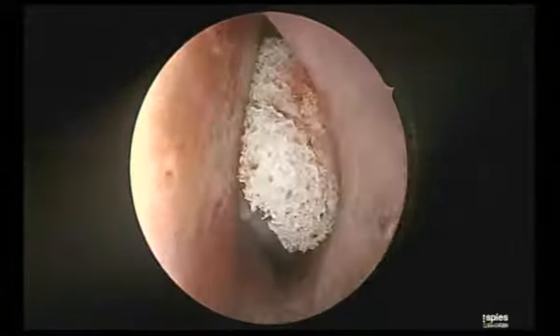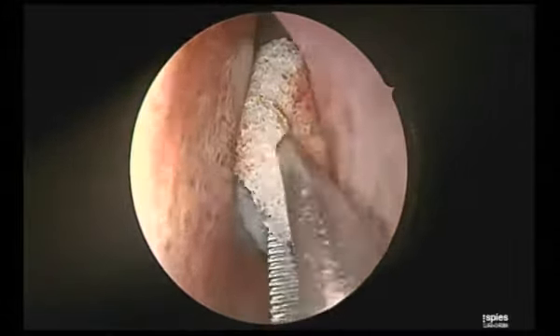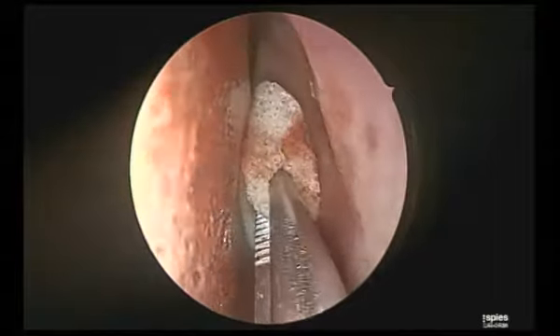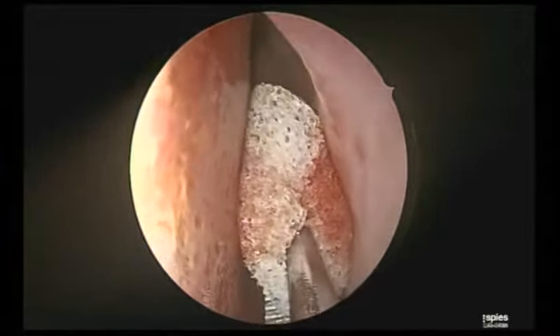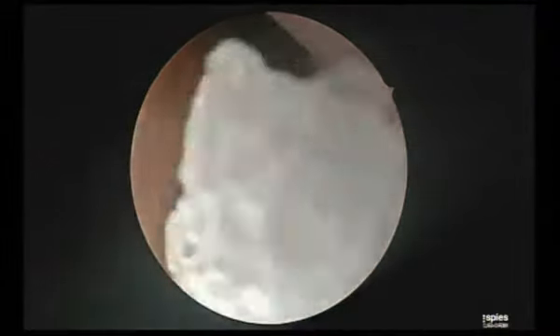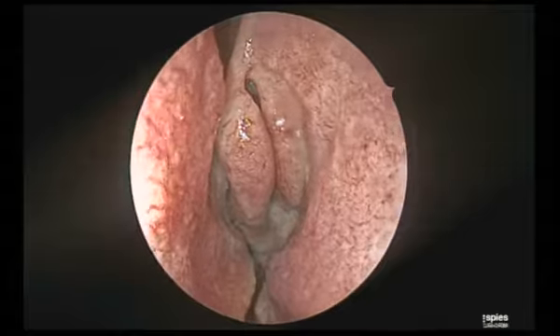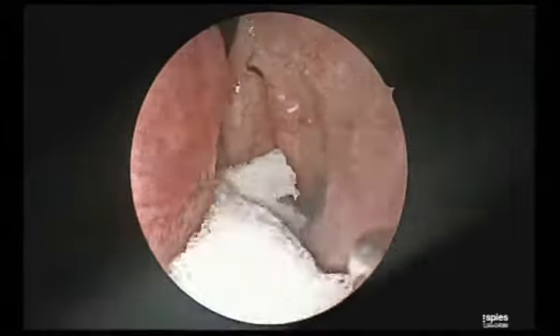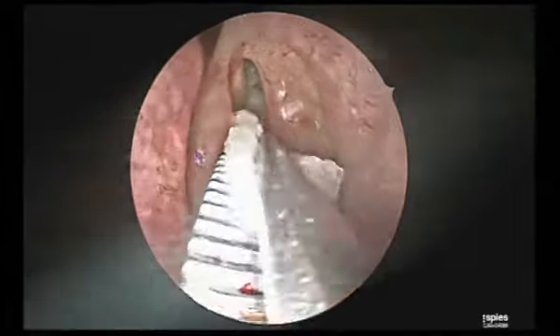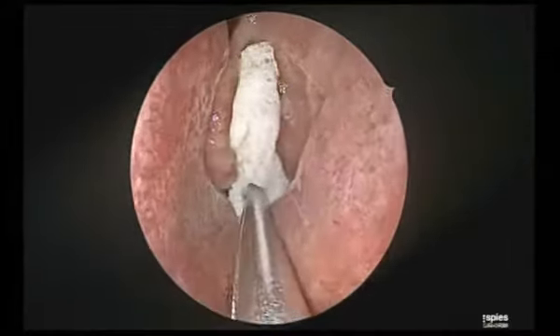If the surgical field is not good, you may not identify the landmarks properly, and then you can end up in complications. This surgery is the surgery of landmarks. We'll see how we pick up one landmark from another. So, other important things to reduce the bleeding, which I take into consideration. Number one, I ensure that the head end of the patient is raised by 15 degrees. That is 15 degrees reverse Trendelenburg position to facilitate the venous return. That's important. It makes the difference.